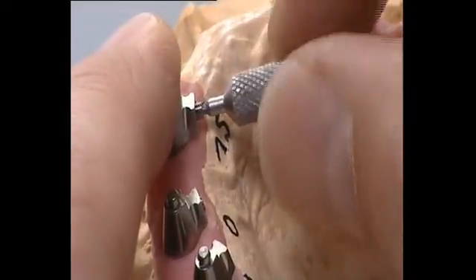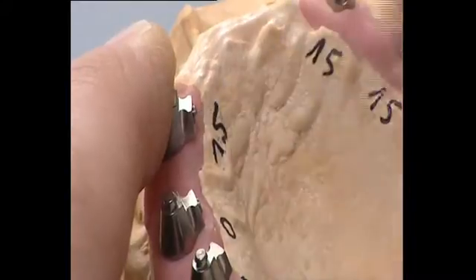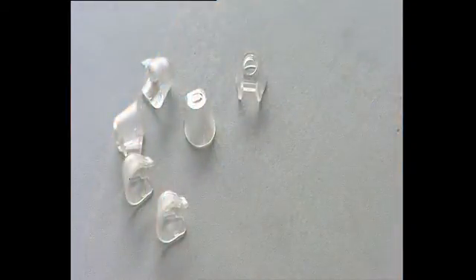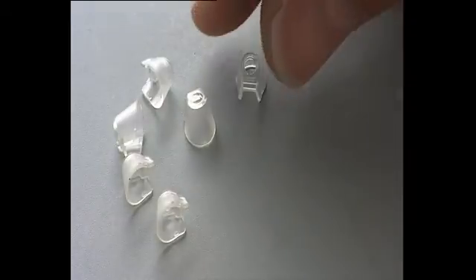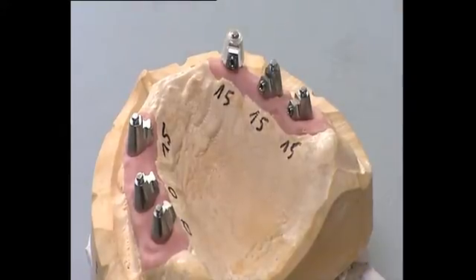The respective titanium copings are placed on the UV-E abutments and screwed in position. The wax-up copings have a defined adhesive gap and eliminate the need for customized fabrication of copings.